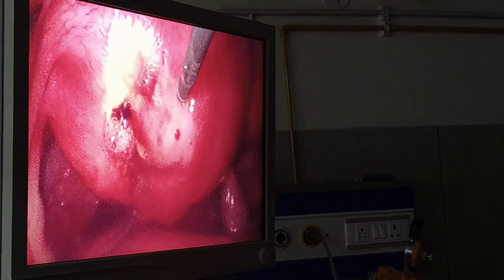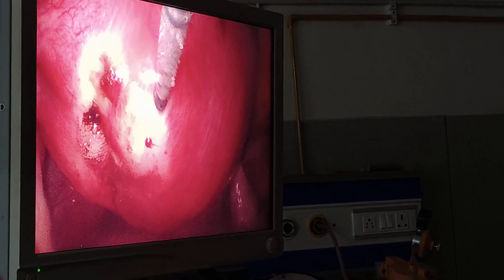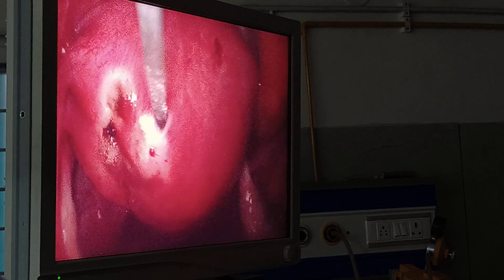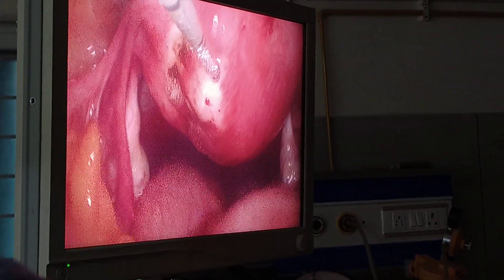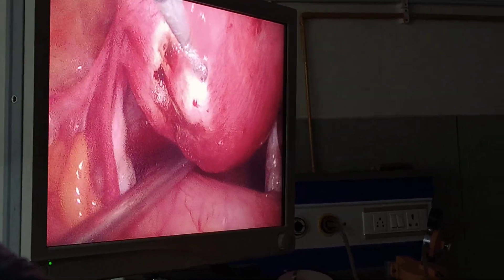I am entering from this side. Check below with the camera — take the camera. So there is no perforation. You have to check the posterior end, whether it has perforated inside, like whether the pelvic cavity was entered or not. No — so this section will support you.